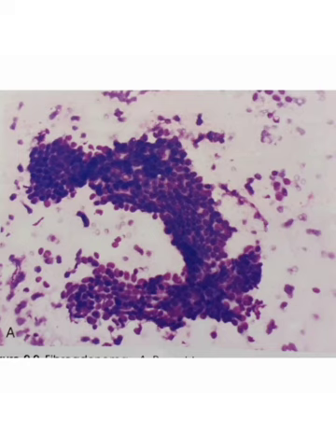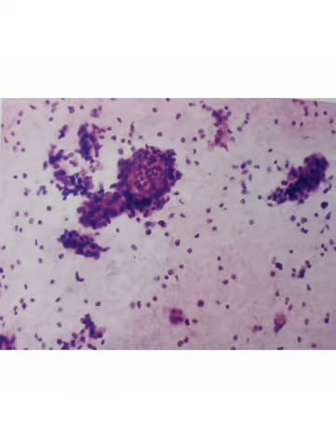Let me show the high power view now. This is the high power magnification. You can appreciate here the cluster of duct epithelial cells having uniform nuclei and bipolar cells in the background. In the background you can see single bipolar cells or bare nuclei, that means without cytoplasm. This is called naked nuclei. These naked or bare nuclei are characteristic of fibroadenoma breast. So there is a cluster of cells with bare nuclei in the background. You can appreciate in this slide very clearly that there are many bare nuclei in the background, which is the characteristic diagnostic finding for benign breast tissue.